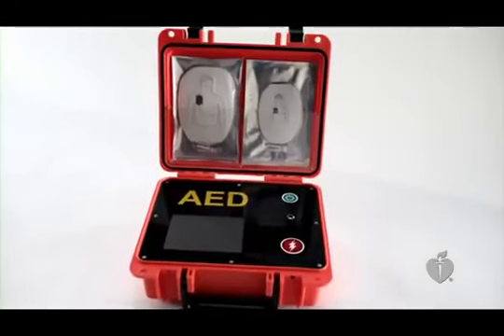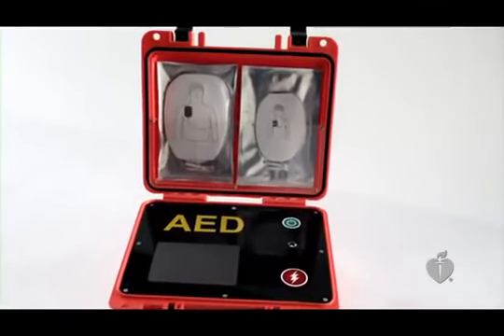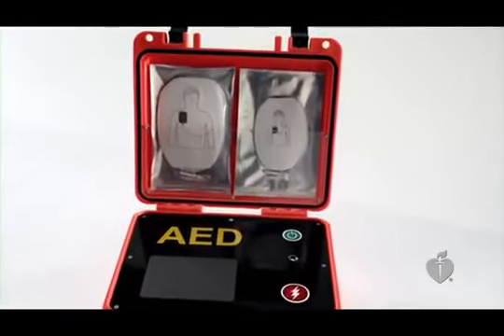We've talked about the differences in compressions and breaths for children and infants, but now let's cover the difference in the use of an AED for an infant or child under 8 years of age. Some AEDs have been modified to deliver different shock doses, one shock dose for adults and one for children under 8. If you use a pediatric-capable AED, there are features that allow it to deliver the child-appropriate shock. Which feature is available depends on the type of AED you are using. If your AED includes a smaller size pad designed for children, use it. If not, use the standard pads, making sure they do not touch or overlap.